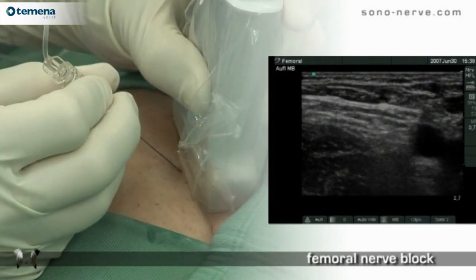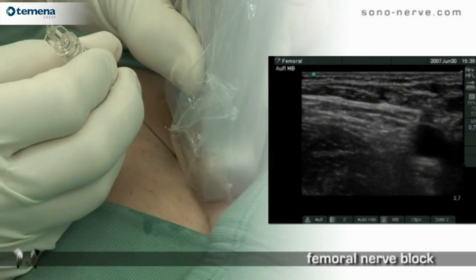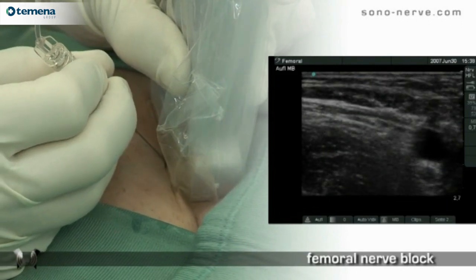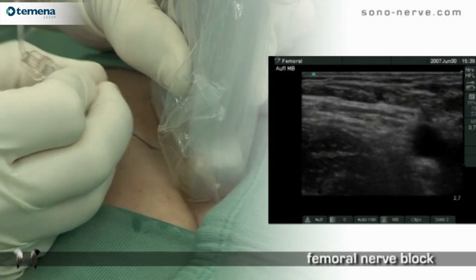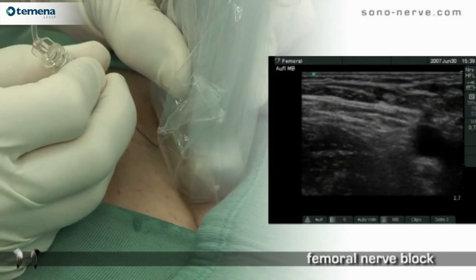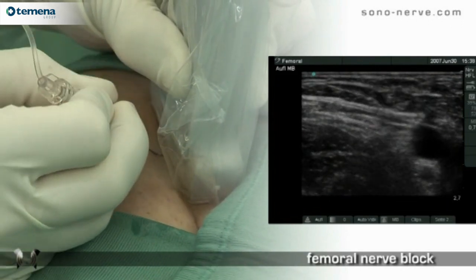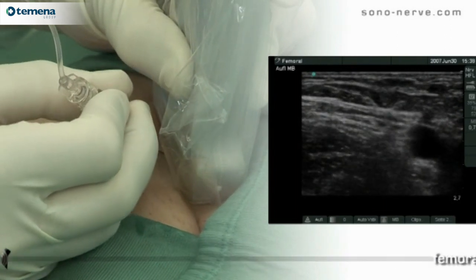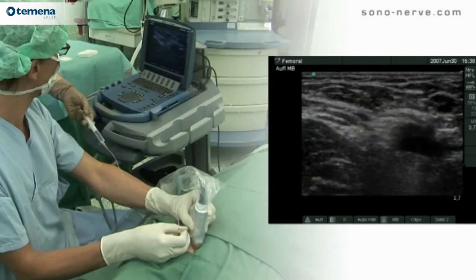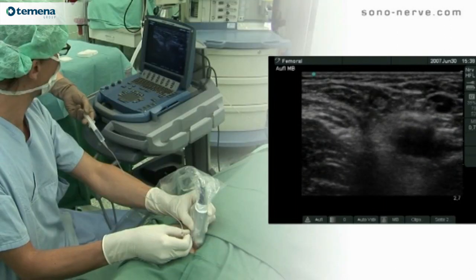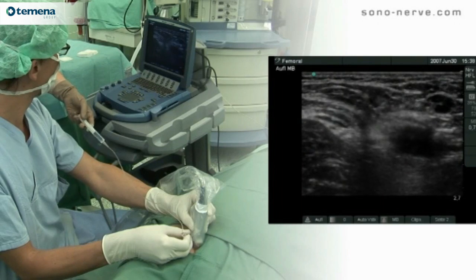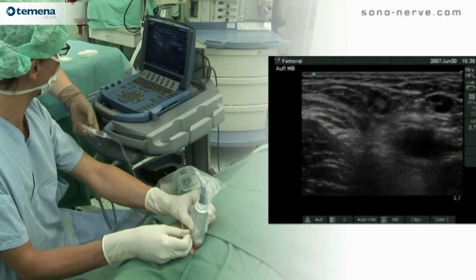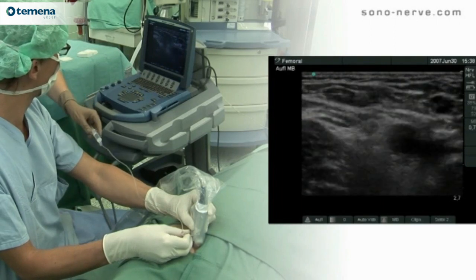Skin puncture can be identified by movement of the tissues and visualization of the needle. The tissues of young people are much more elastic than those of old people, and it's often quite hard to pass the needle through them.